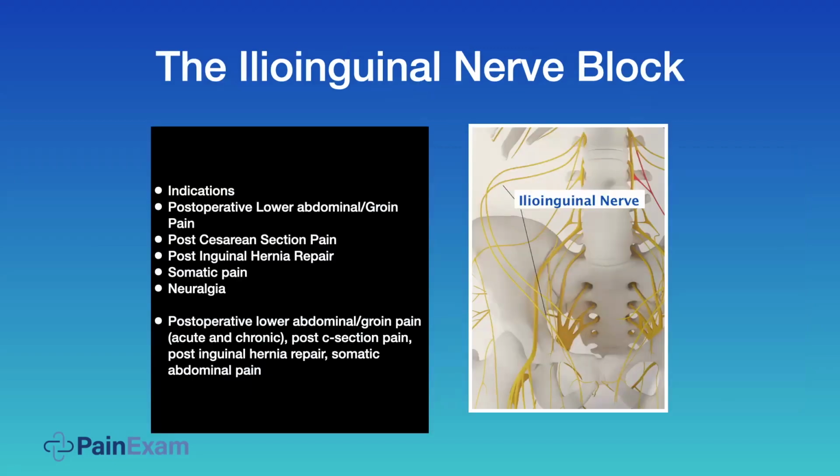I'm going to move a little quicker here because we still have a lot more to go, and I don't think I'm going to take a break. So if you need to take a break, you could just watch the replay where you'll have access to everything. It's just that we have the spine to do, and we're almost there. So let's finish with this.